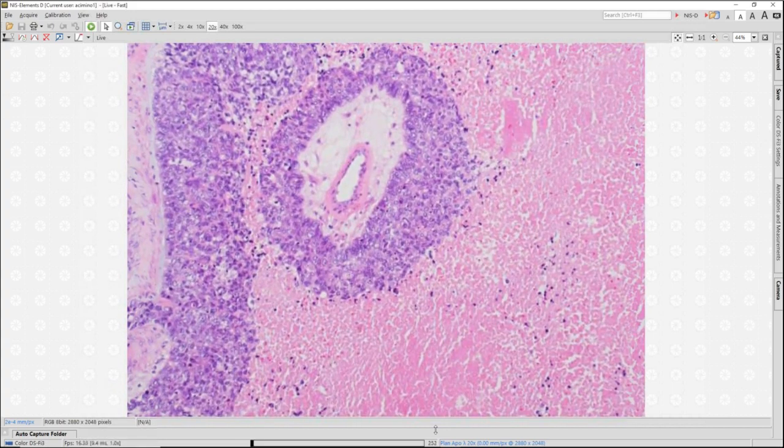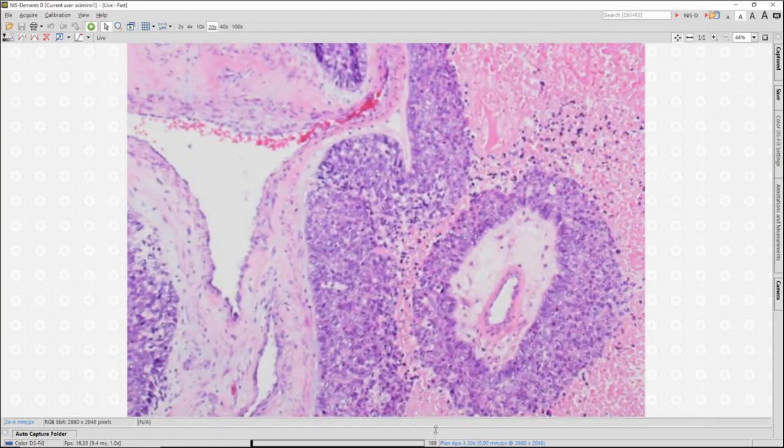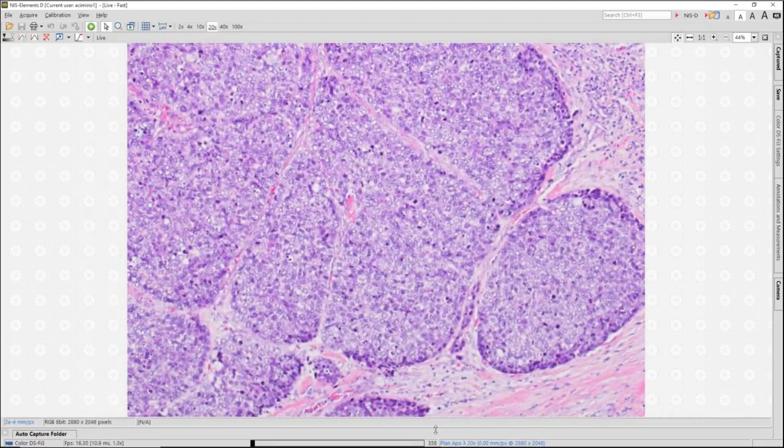This would be better served as saying it's a high-grade carcinoma. It shows some papillary features based on this morphology, the structure, but you don't want to call the encapsulated papillary carcinoma variant, which would be staged as in situ.